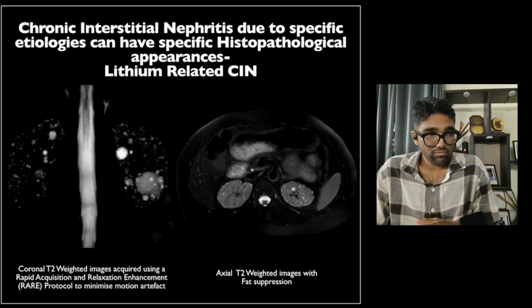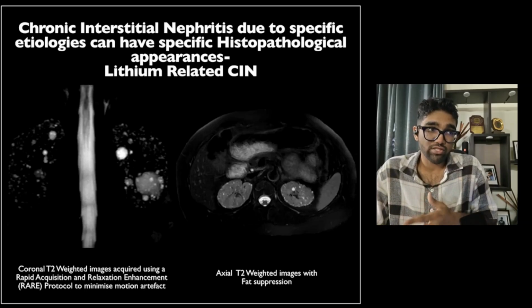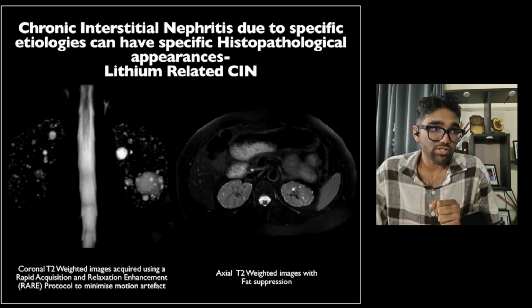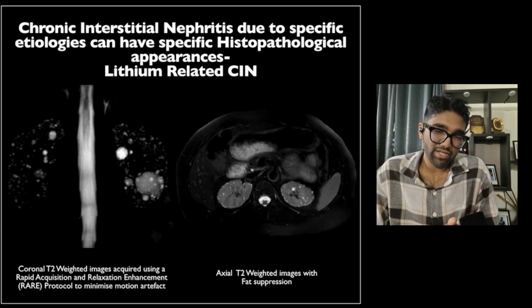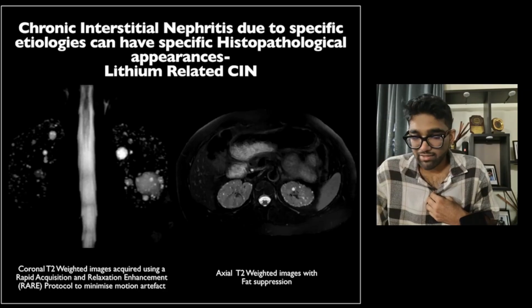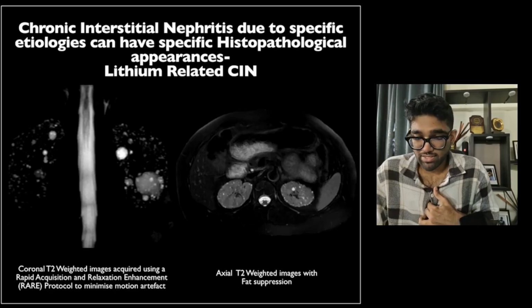However, again, we've discussed lithium as a cause of renal damage in multiple situations. We've discussed it in membranous nephropathy, and as a cause of FSGS. We've discussed it as causing tubular injury, and being a drug, it can cause interstitial nephritis. So sometimes when you have a patient with suspected lithium related renal dysfunction, it still requires a biopsy, even if the imaging is showing these cystic changes.